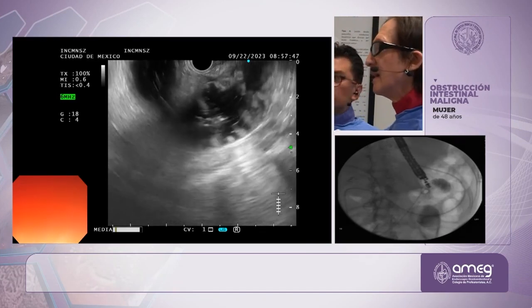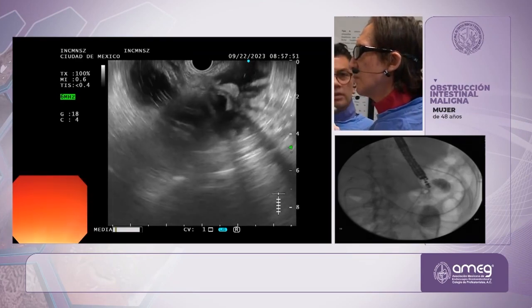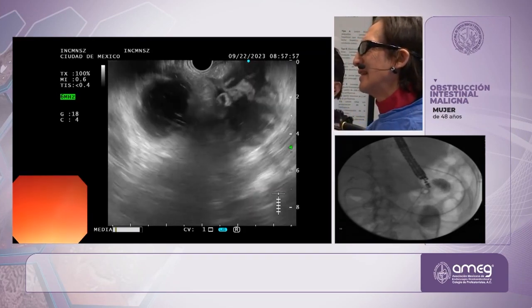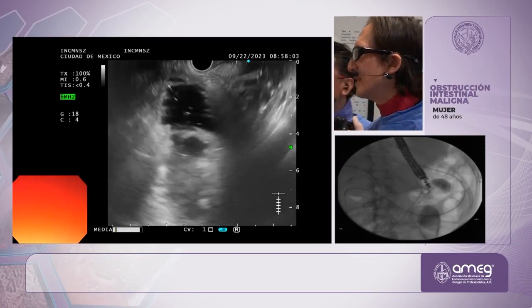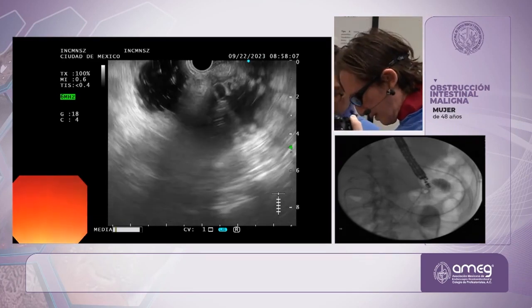If you have total obstruction in a patient, what do you do? Total obstruction. How do you proceed in that case? And you said you don't do this. Exactly. That's the answer. Any option in that situation? With total obstruction. It's the question in the audience. Okay. ¿Escucharon la respuesta?